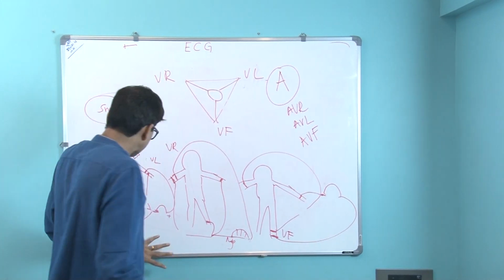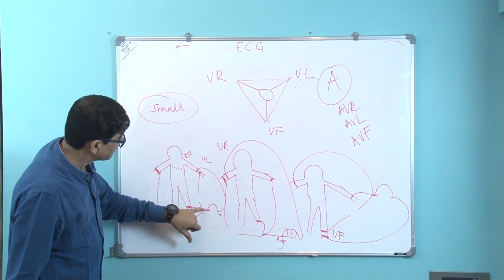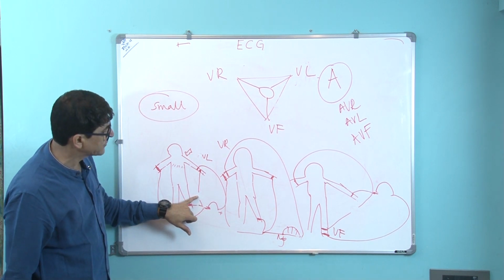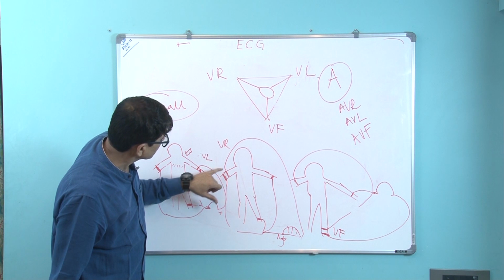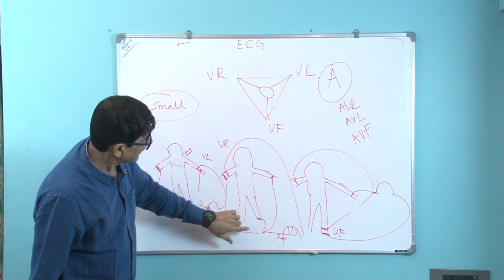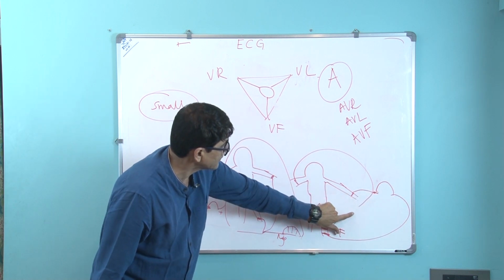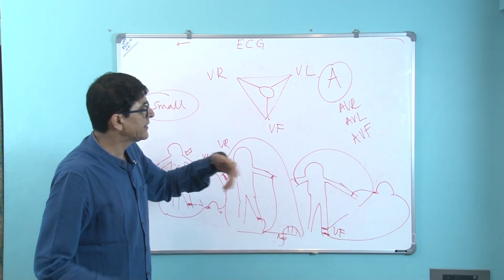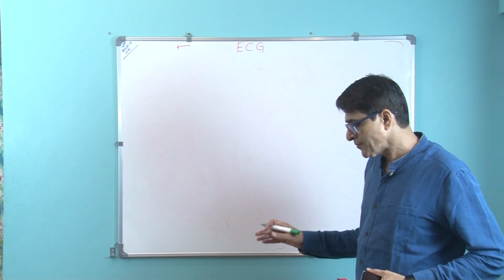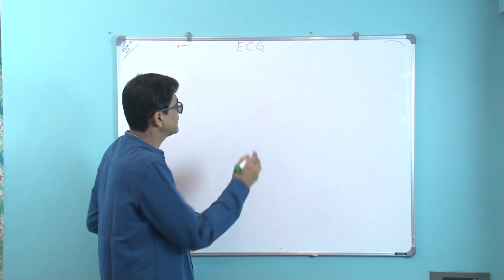So by just disconnecting from the central terminal the lead which you want to explore, I want to explore this. So here I have disconnected this, I want to explore this. So I have disconnected here because I want to explore this. So this is the exploring electrode. From the central terminal I have disconnected this and it has increased the deflection of the ECG complex. We have seen the 3 augmented leads. Now we see the 6 chest leads.